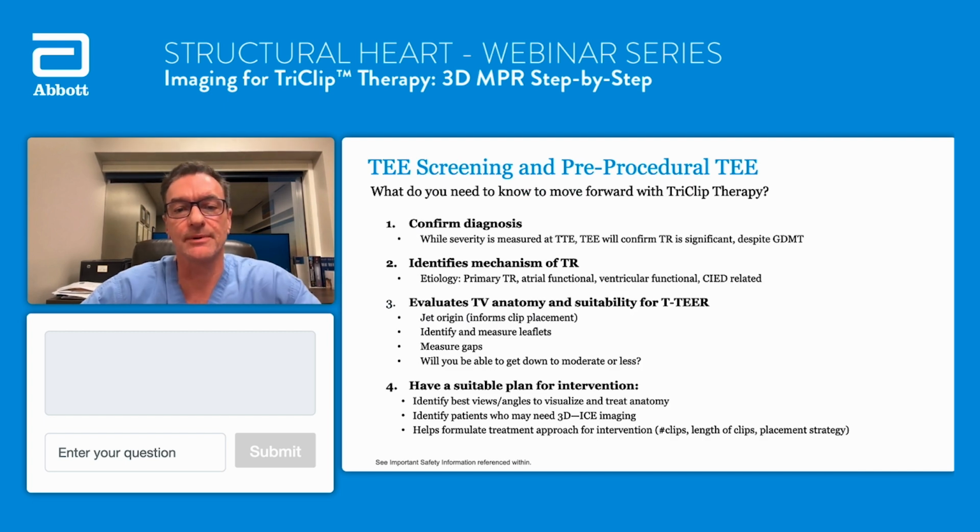We have already had a webinar, and I'll quickly review some of the things we talked about. The TEE screening and the pre-procedural TEE are very important, and we're going to focus today mostly with Dr. Safi taking us through MPR. But what do we need to move forward for the consideration of TriClip therapy? First is to really confirm the diagnosis, and that can be initially through a transthoracic echo. TEE typically is to confirm the mechanism of the TR, and also to do that formal evaluation for the elements of TriClip therapy, including gap, width, and all of the imaging views that you need during the TEE of the procedure. You also have to identify the mechanism of TR.